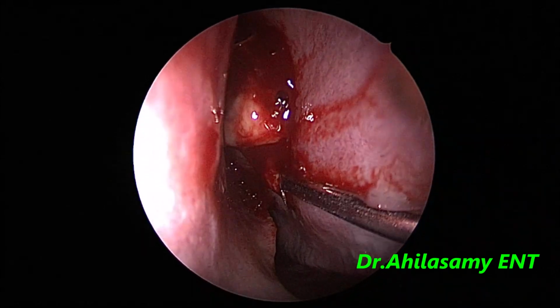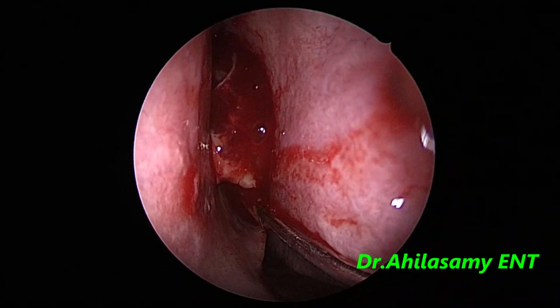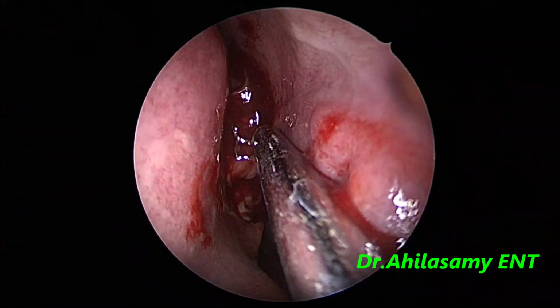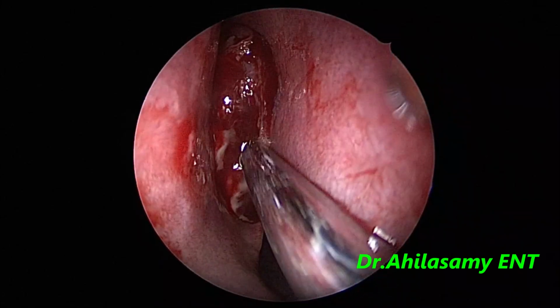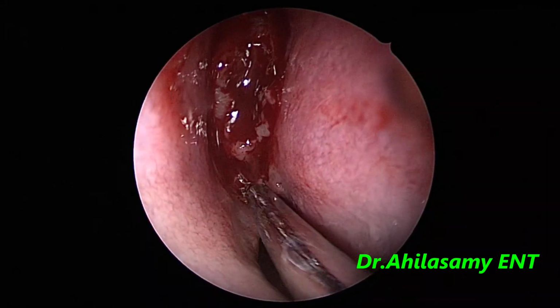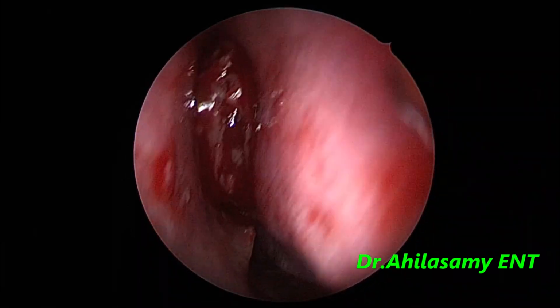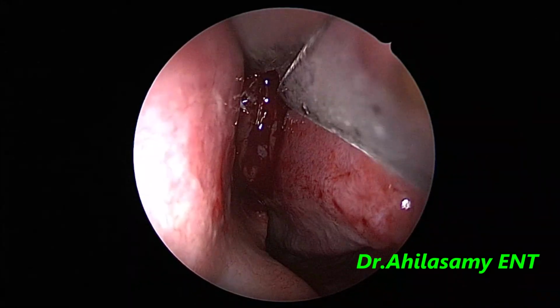The uncinate dissector, he could very well dissect. The middle turbinate is hardly visible so far, and the patient is very comfortable. Because of a lot of inflammation, it's bleeding a little, even though I have treated the patient preoperatively for 5 days with itraconazole 100 milligram twice a day and prednisolone 10 mg twice a day.